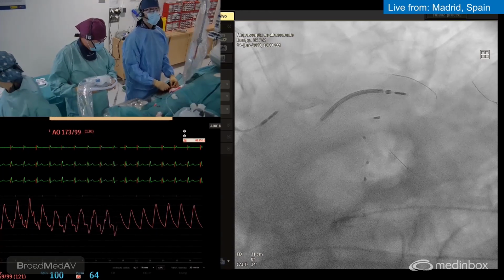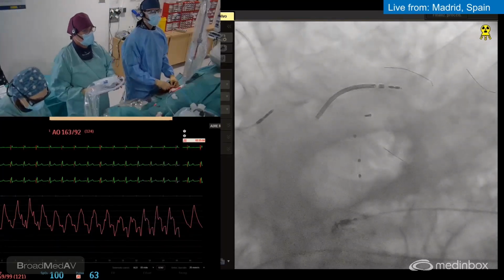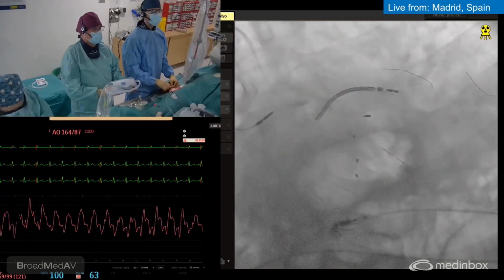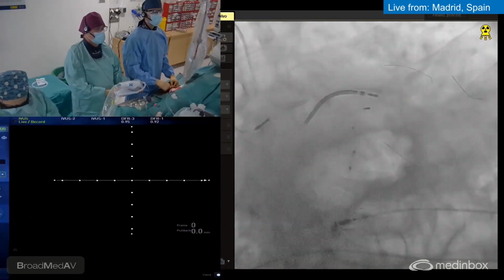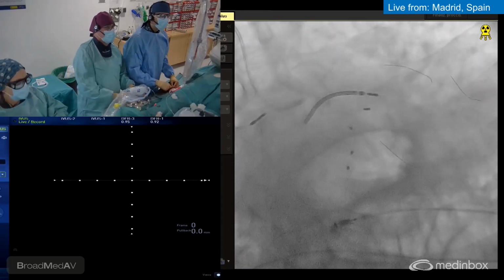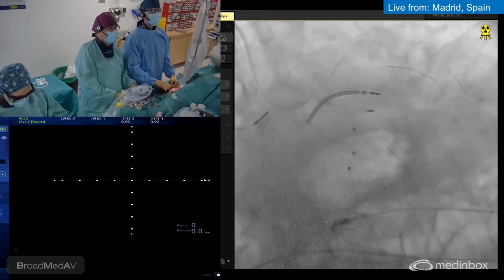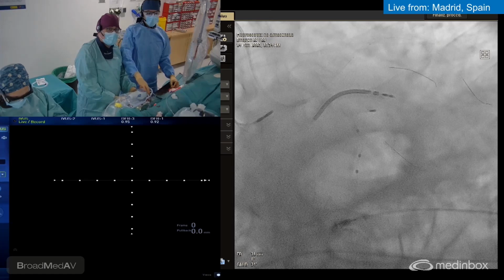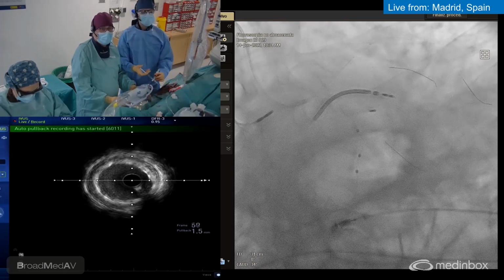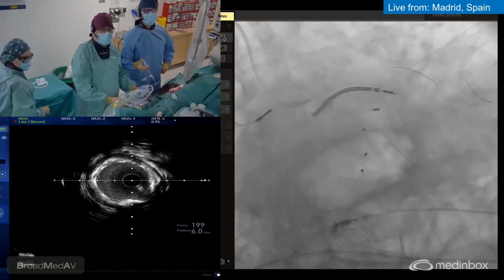We're going to check the proximal stent because the previous stents were checked before in the last pullback. Probably there. More distal. A little more. I think yes. Perfect. Pullback. It's very good. These are the previous ones, I think.